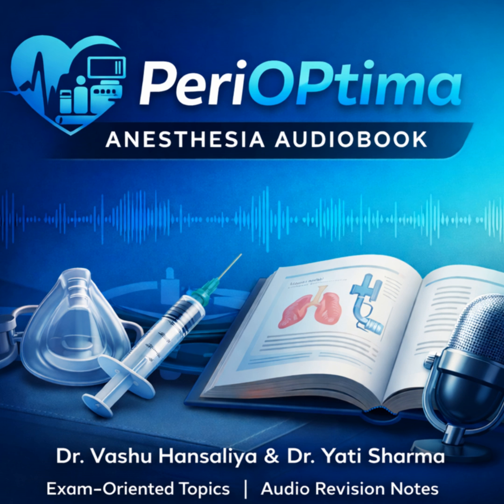Right, the Tech 6 is complex for a reason. Desflurane's vapor pressure is incredibly high, so it nearly boils at room temperature. A normal vaporizer can't handle it. So the Tech 6 is heated. Exactly. It's electrically heated to a very specific 39 degrees Celsius. This creates a high internal pressure of about 2 atmospheres in the reservoir. And then it injects pure vapor into the gas stream.